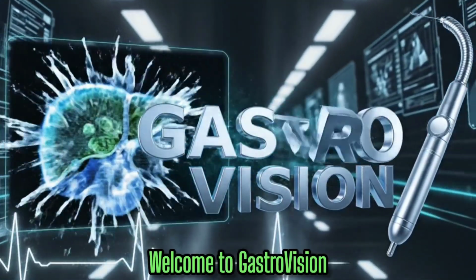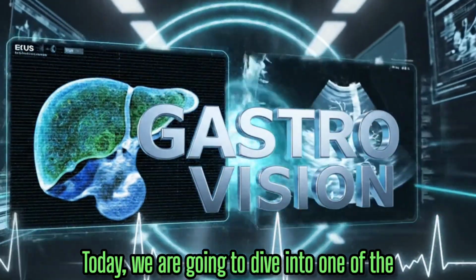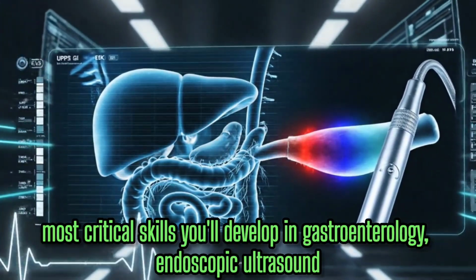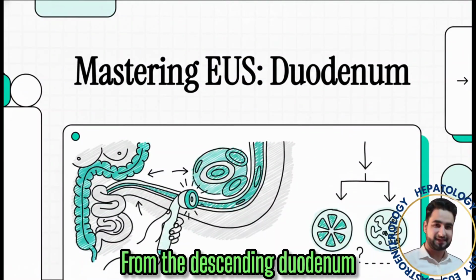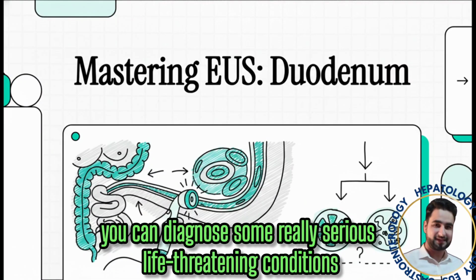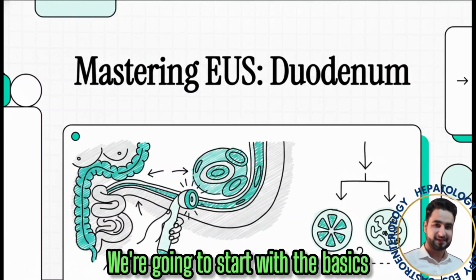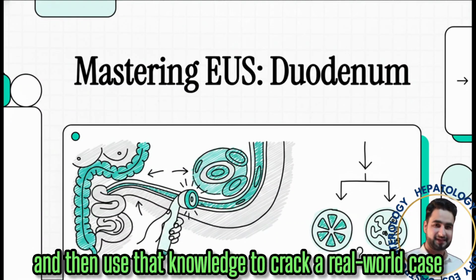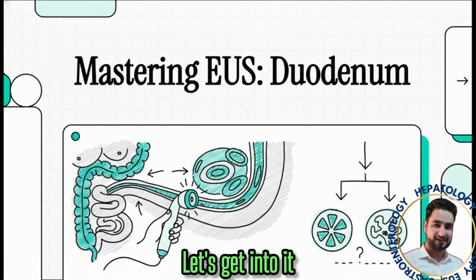Welcome to GASTRO VISION. Today, we are going to dive into one of the most critical skills you'll develop in gastroenterology, endoscopic ultrasound, from the descending duodenum. So why is this so important? Well, because from this single vantage point, you can diagnose some really serious life-threatening conditions. We're going to start with the basics, nail down the normal anatomy, and then use that knowledge to crack a real-world case. Let's get into it.